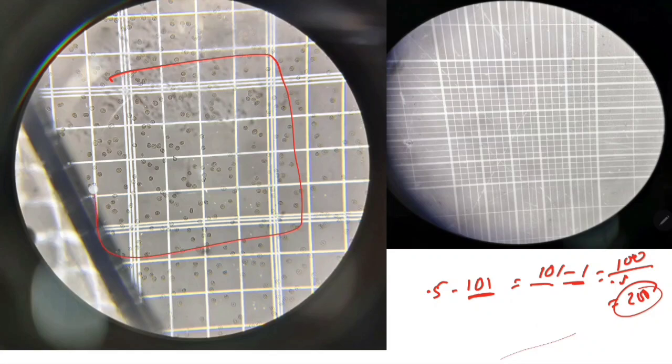Then after focusing, we must consider this triple line, the center line, as the reference line, and any cell touching the center line from the upper and left side we will consider inside the cell. With the same formula, if any cell is touching the middle line or center line from the other side, we will consider it outside the cell or in the next box. So we'll consider this cell in the next box. So this cell will go here and this cell will go to the next box.